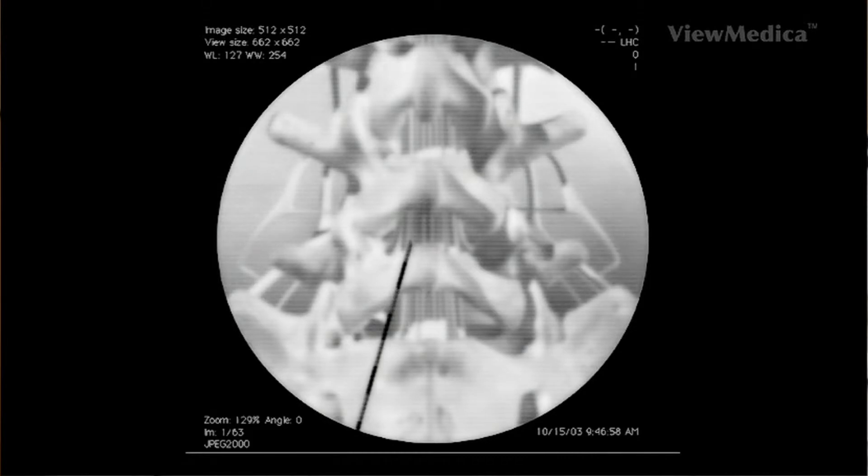The fluoroscope provides live x-ray images. We then use the fluoroscope to confirm the location of the needle's tip once we have confirmed that the needle is positioned correctly.